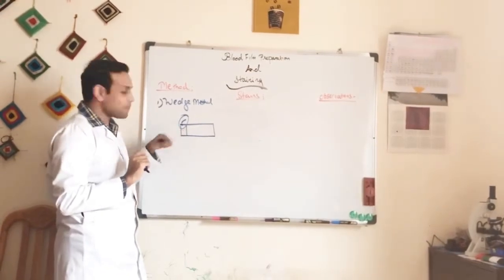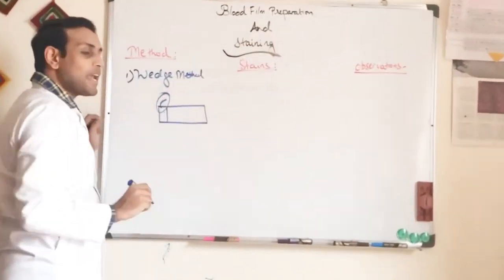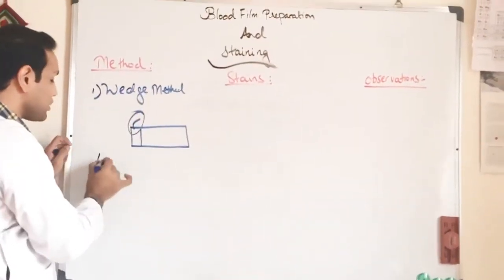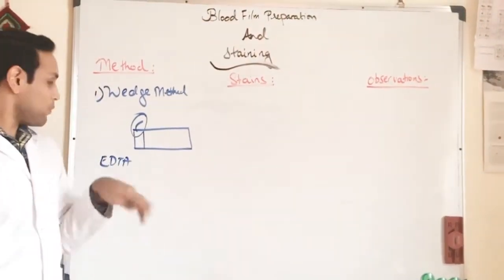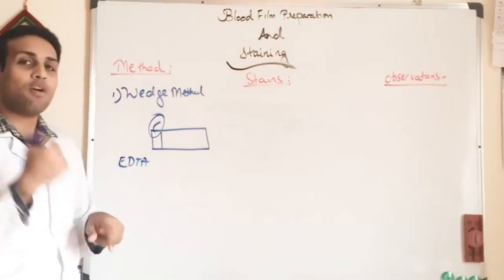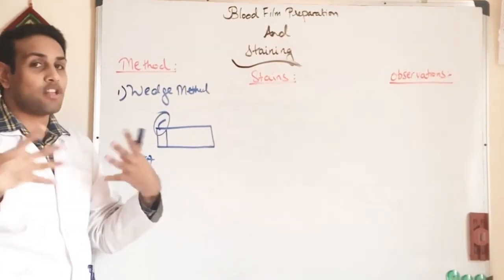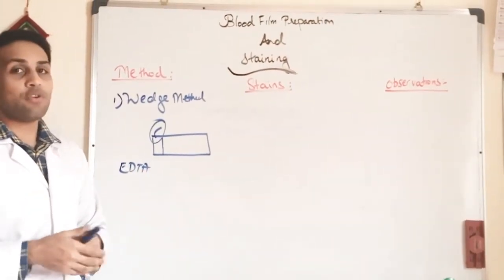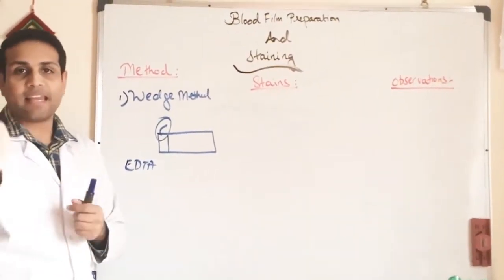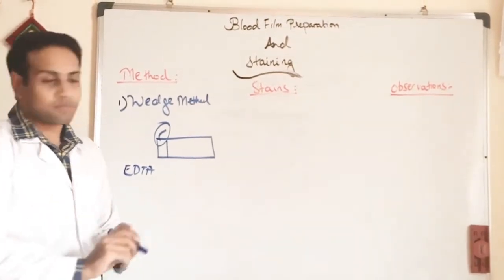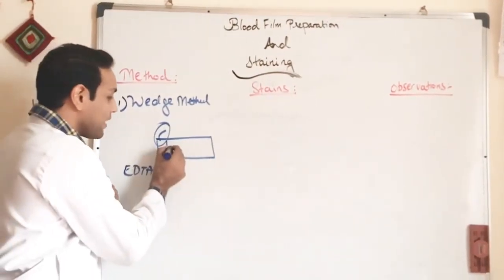After noting the patient's information, we take a drop of blood. Since we are working in a hospital setting, the sample comes from an EDTA tube. We take a drop from it and place it on the slide. Alternatively, for a quick blood smear in a small clinical setting, we can use a finger-prick and place a drop of blood directly onto the slide and immediately prepare the smear.